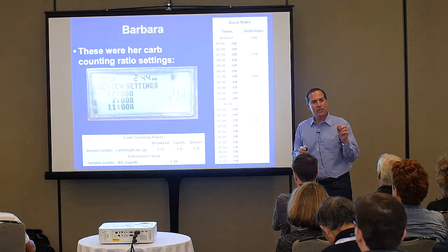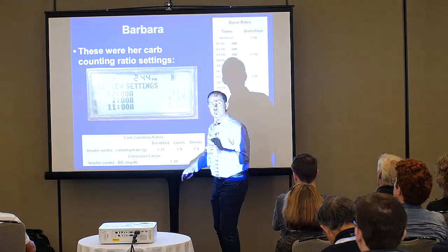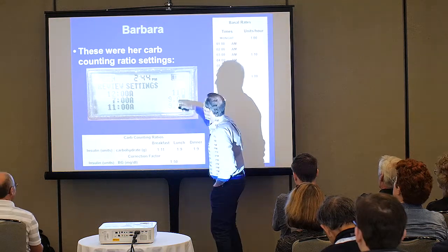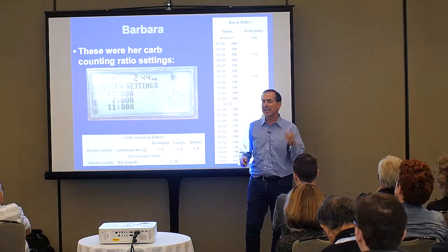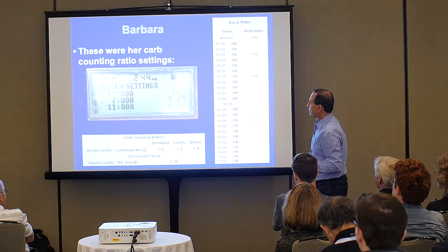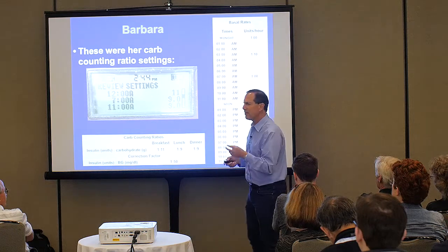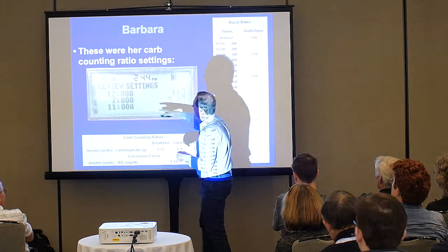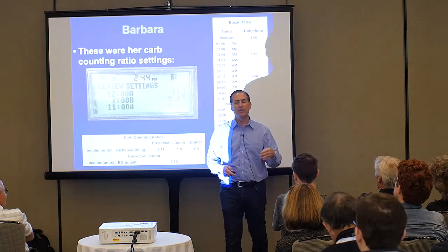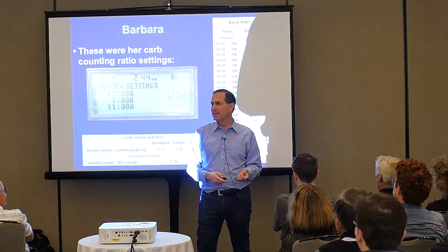Not right now, but I really hope that you'll look at your own carb counting ratio times. And I bet a handful of you are going to find that you're eating breakfast at different times, even a few minutes apart, and getting a very different amount of insulin. So what I do with a patient like Barbara, I say, what's the earliest you ever eat breakfast? And if she says, once a week I'll get up at 6:30, I say, fine, we're going to change your breakfast carb counting ratio to 6 a.m. so you always get the correct ratio you're supposed to get for breakfast. All right?